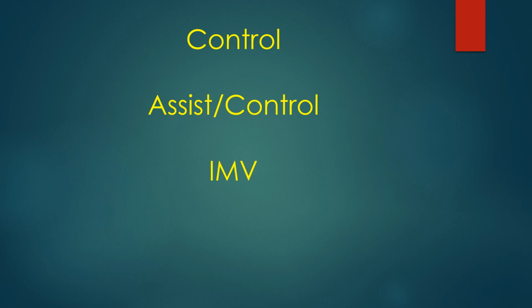and it was just not a very useful thing for patients. After a while, though, somebody else figured out a way that we could let the patient breathe spontaneously, so that when he made an inspiratory effort after his machine breath, before the next machine breath would come, he could just take his own spontaneous breath, not a breath forced on him, not a mandatory breath, just spontaneous. And they call that IMV, intermittent mandatory ventilation. So the patient would be breathing spontaneously, and intermittently the machine would give him a breath. So that was about it with modes of ventilation way back then.